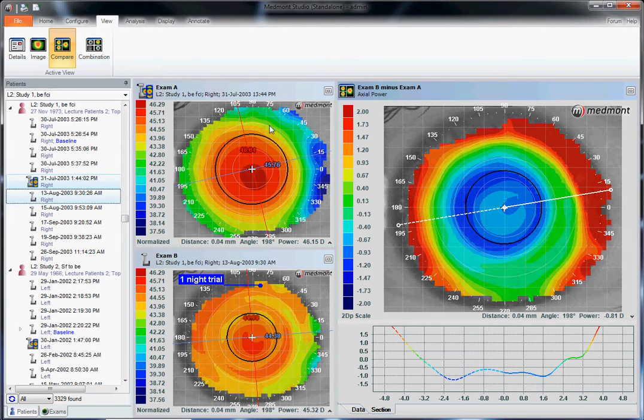Here is your baseline, your earlier image. Here is your later image, your post-treatment topography. The larger view on the right-hand side is your subtractive map. Wherever you see blue, you flatten the cornea over time. Wherever you see red, you steepen the cornea over time or between these two visits.